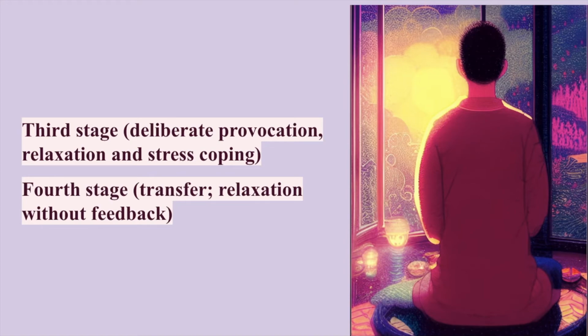Now a selective stressor should be applied. This can be a certain thought, sound, or image with a negative connotation. Almost every person knows certain things or situations that distress them, and then under the influence of such a stressor, they're asked to relax and bring it down again and reduce spontaneous fluctuations. But this is again more for therapeutic training purposes.